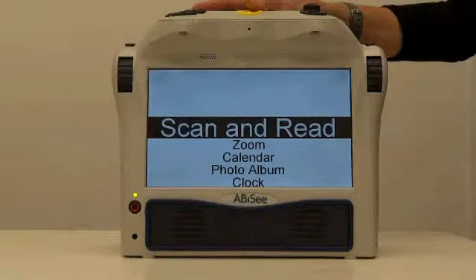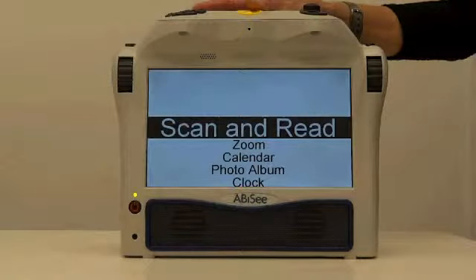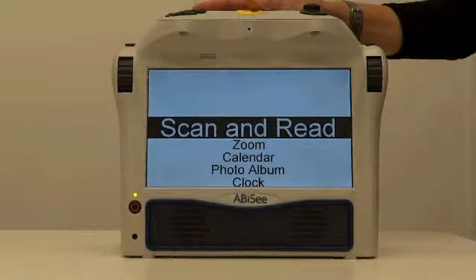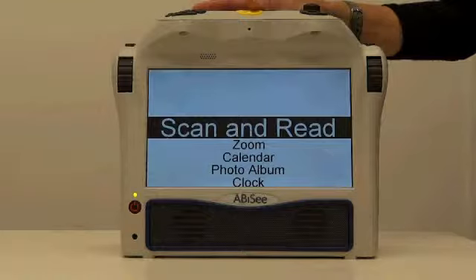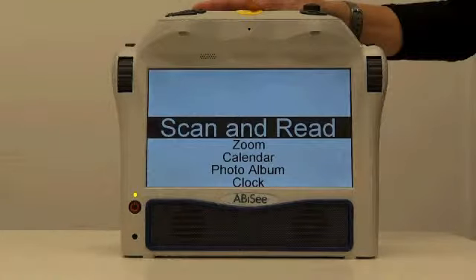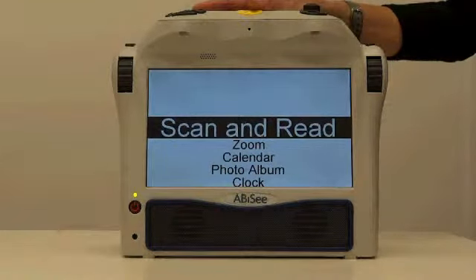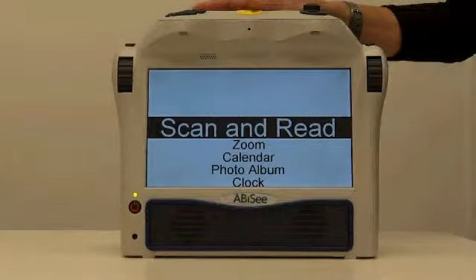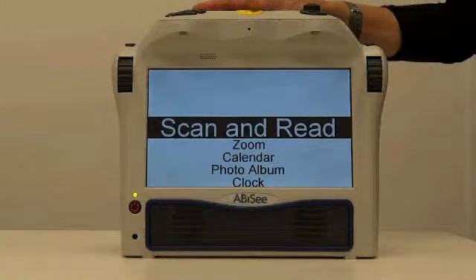Scan and Read. The Scan and Read option allows you to scan printed text like documents, books, food packages, pill bottles, and even fine print. The IPAL ACE will read the printed material aloud and display magnified text on the screen.